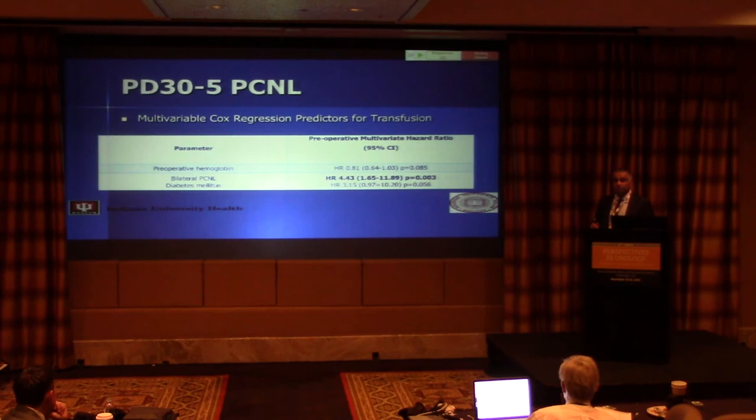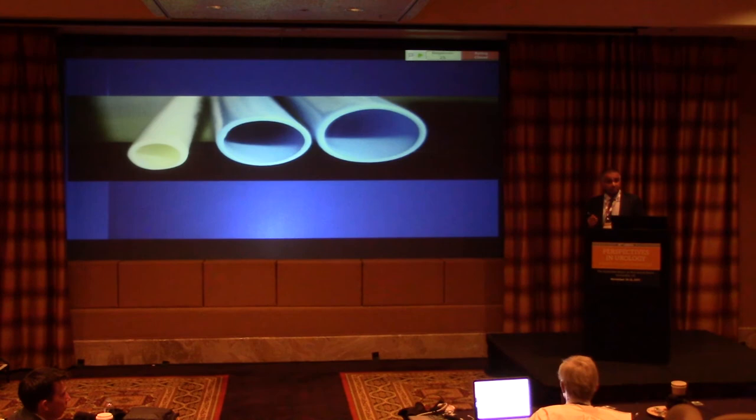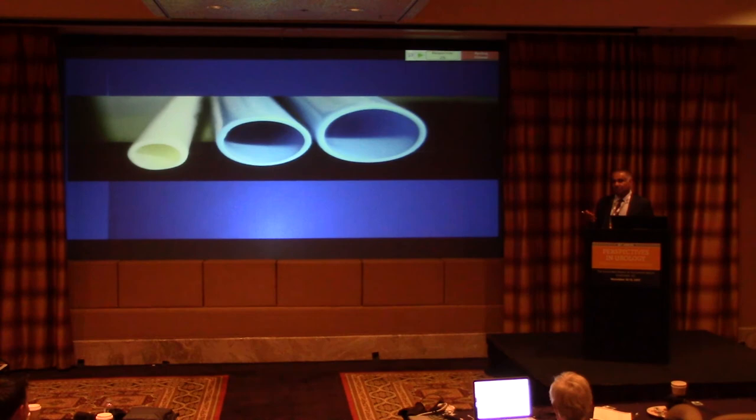So we wanted to talk then about size. I mentioned our series there, 4.3% transfusion rate, dilating to 30 French. Though it seems to make sense that smaller might be better. How many people own a gun? Okay. So you may know that smaller caliber bullets actually cause more trauma than larger caliber bullets. Now I'm not a gunman, so correct me if I'm wrong. So sometimes what you think in terms of size of hole doesn't really correlate to the amount of damage.